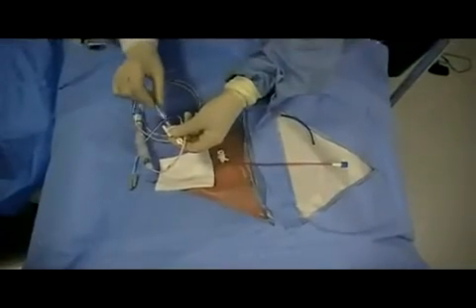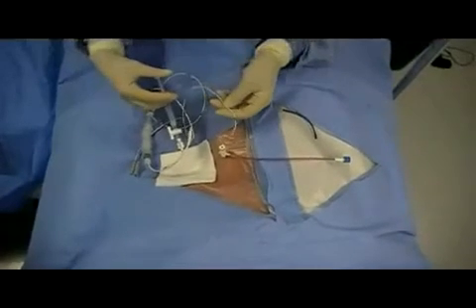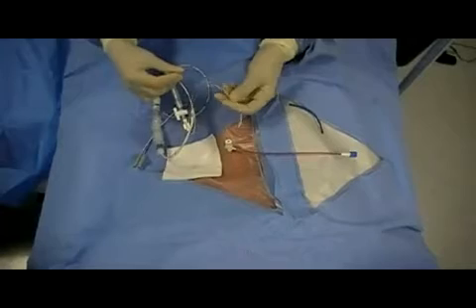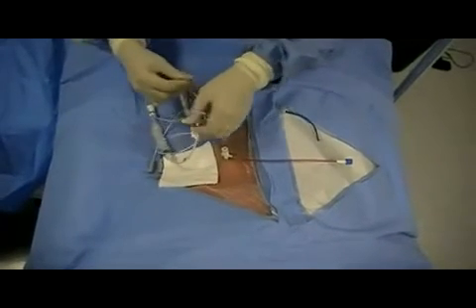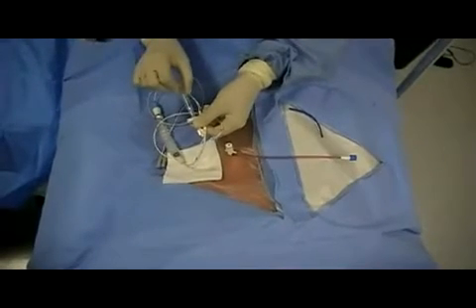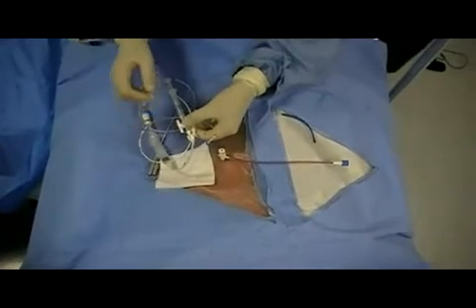Next, the balloon is tested at the distal tip of the catheter to ensure that it inflates properly. This usually requires approximately 1.5 cc's of air. Once proper functioning of the balloon is verified, the balloon should then be deflated.